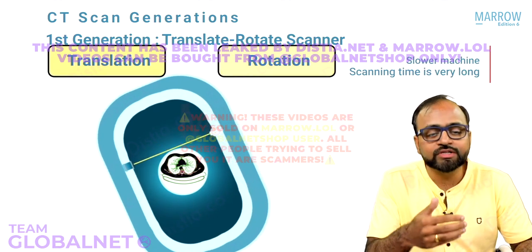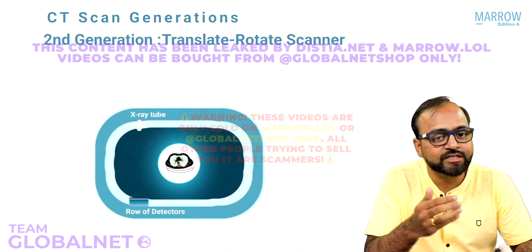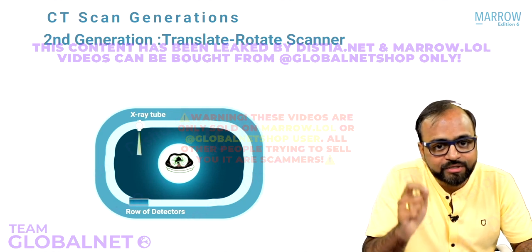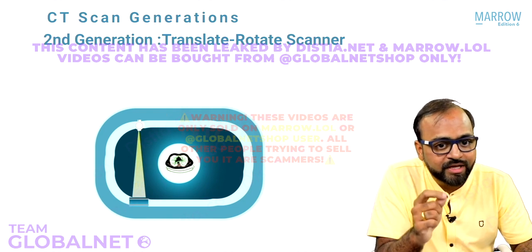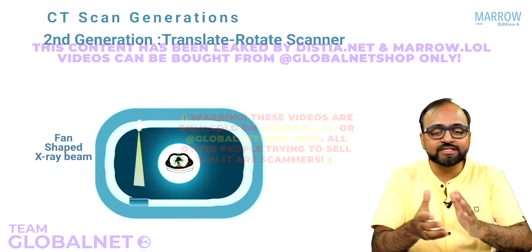Now, just see what is the difference between first generation translate rotate scanner and second generation, which is also called as translate rotate scanner. But look at the animation here. What is the difference? Is it a pencil shaped X-ray beam? No, it is rather a fan shaped X-ray beam which is there.